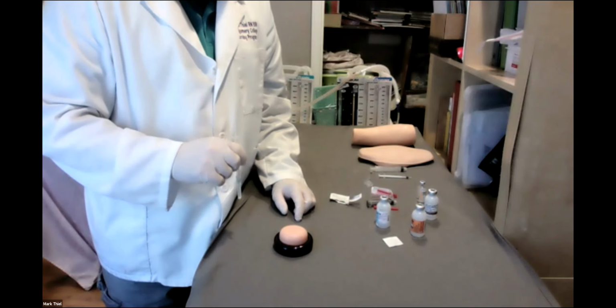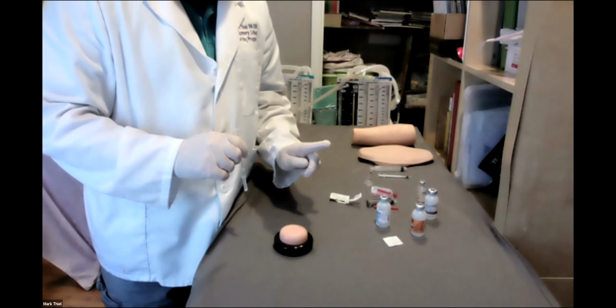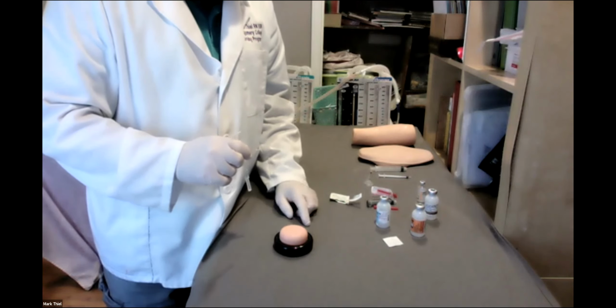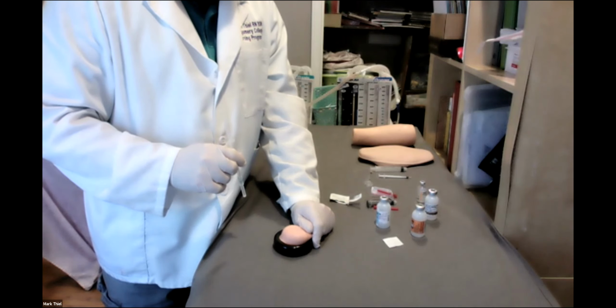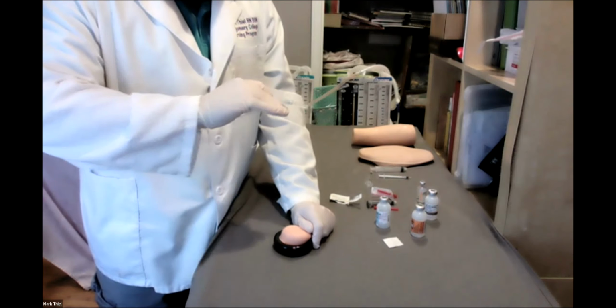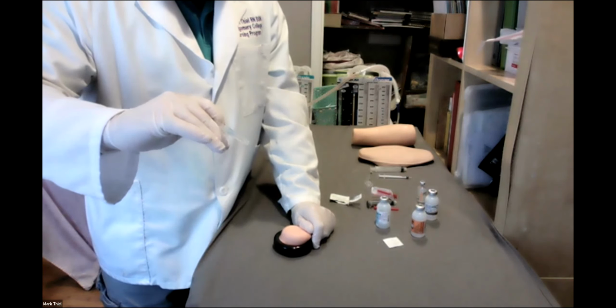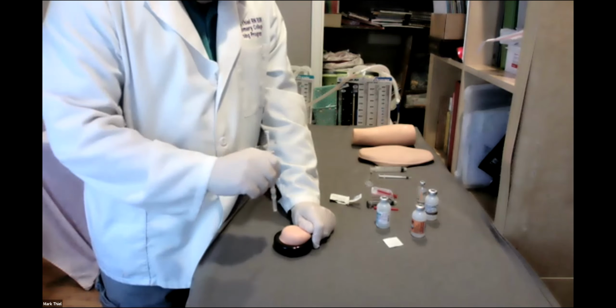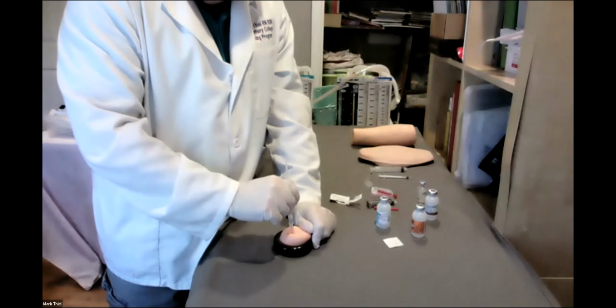The Z-track. What is the Z-track? We pull the skin aside to move the dermal layer and the subcutaneous layer aside for a moment. Then, process wise, I will do my injection. Right?